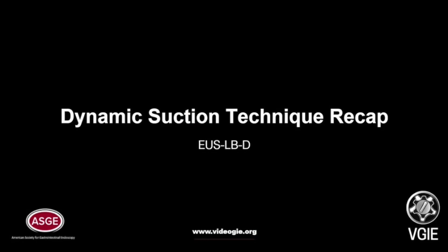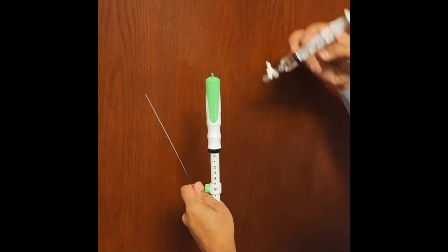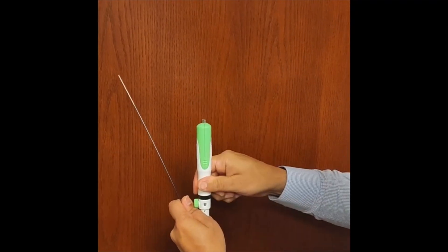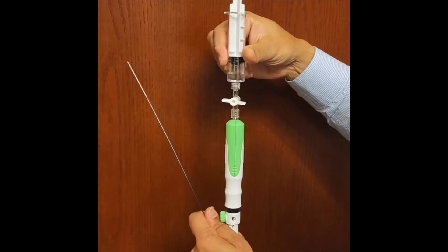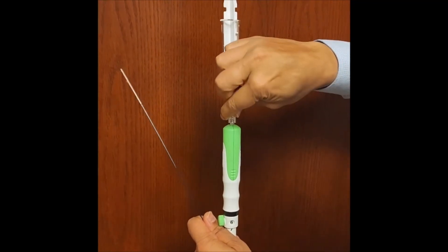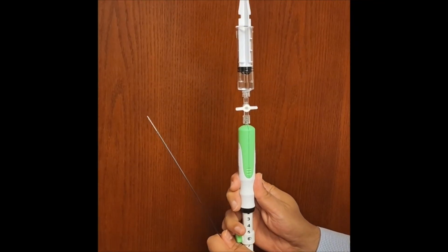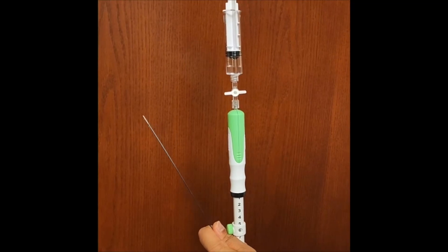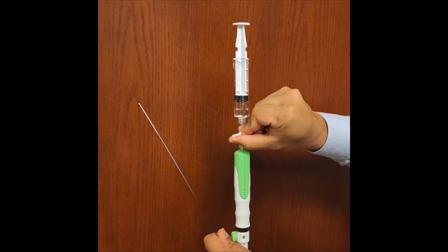Here is a recap of the dynamic suction technique. The first actuation has no stopcock syringe attached. Firm throw. Syringe is immediately attached. Suction on. Suction off — fixing the needle. For the next throw, right before the actuation: suction on, throw, suction off.